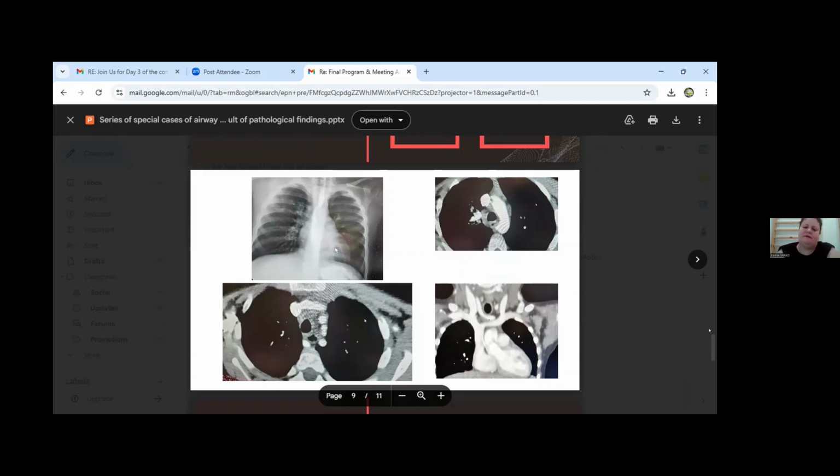This is a 2-year-old child with recurrent pulmonary infections, and we first performed an esophagogram in the first picture, and you see that, like in the first case, the esophageal lumen is reduced and the esophagus is compressed by a mass effect, but this time not from a duplication like in the first patient, which is a cystic formation. In this case, it is an aberrant structure.